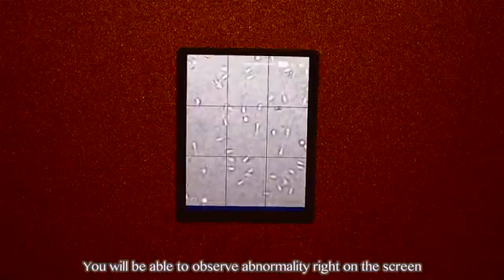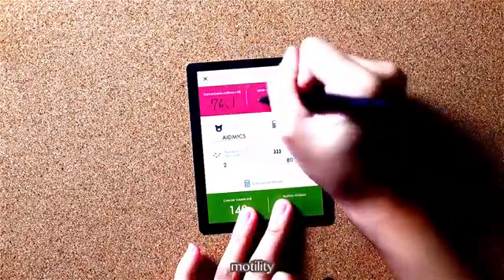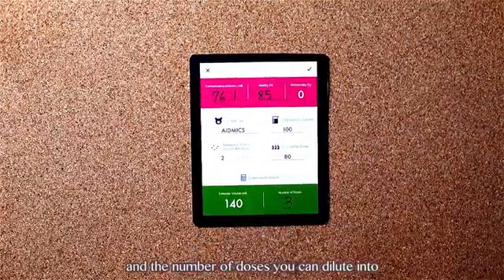You will be able to observe abnormality right on the screen. iSperm can calculate concentration, motility, and the number of doses you can dilute into.